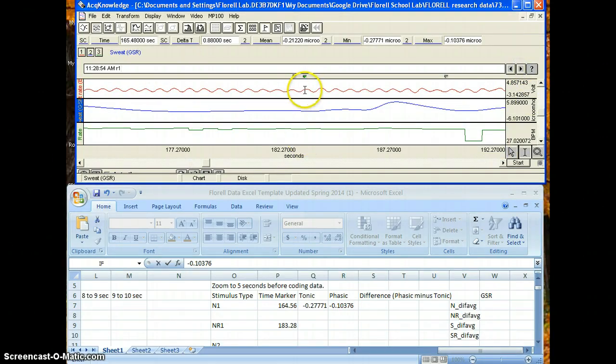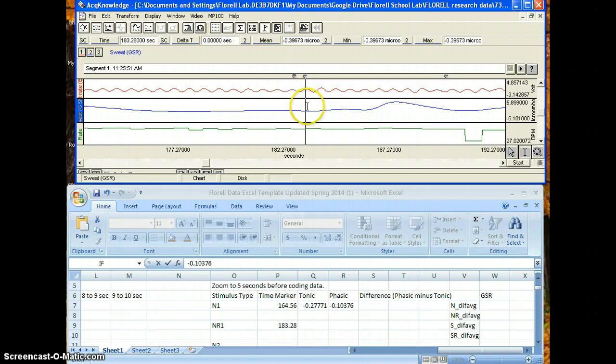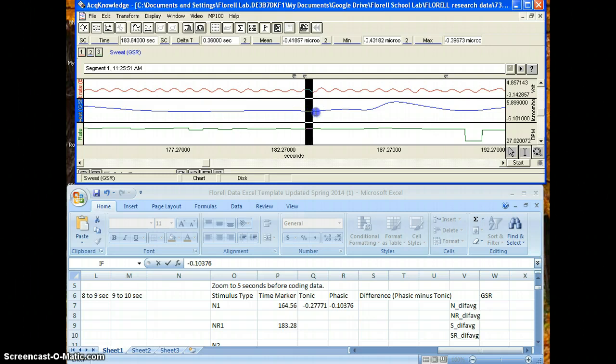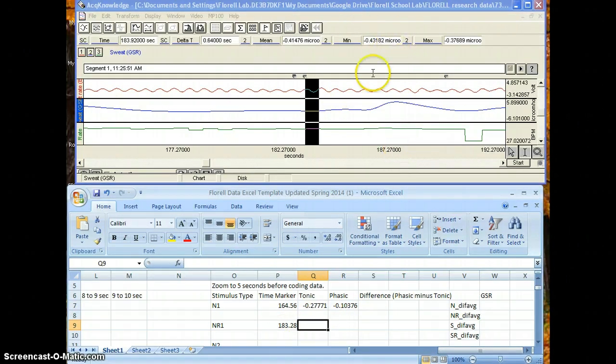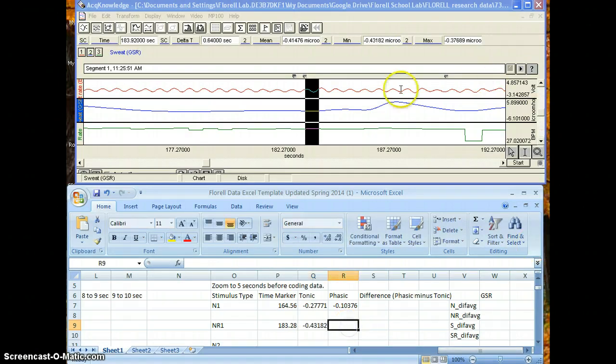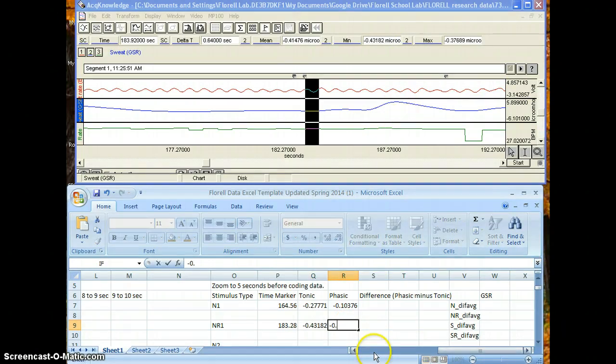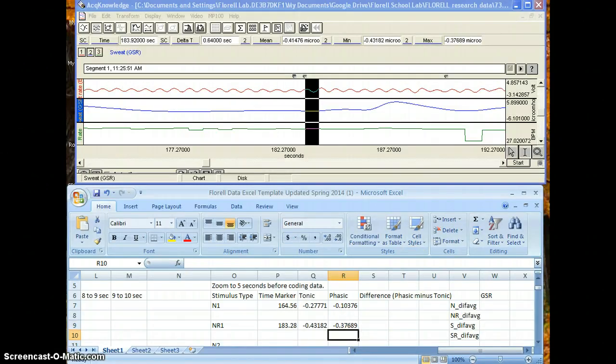But this one, this one's not really flat. As you can see, it makes a big dip. It's probably flat enough to go to about right here. You just need to be careful with GSR because it can be tricky. You can't analyze data that's all over the place with a whole bunch of hills and bumps. But your tonic once again is your min number, so -0.43182, and your phasic once again is maximum, so that is -0.37689. And you do that same process on down.